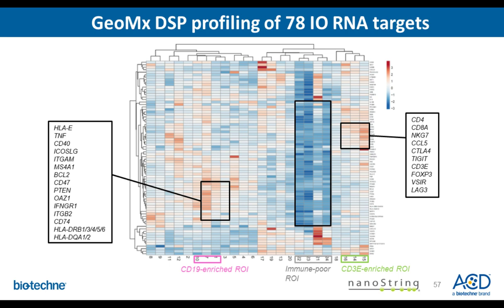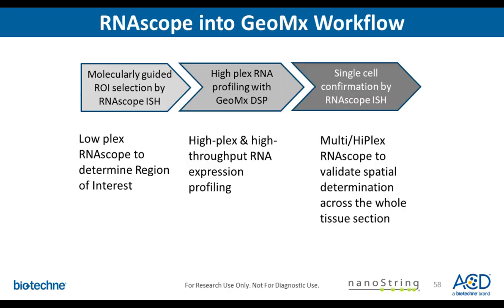And now, for the last step, we went in and confirmed some of the results with RNAscope. So I'll hand it off to Anushka to go over that.